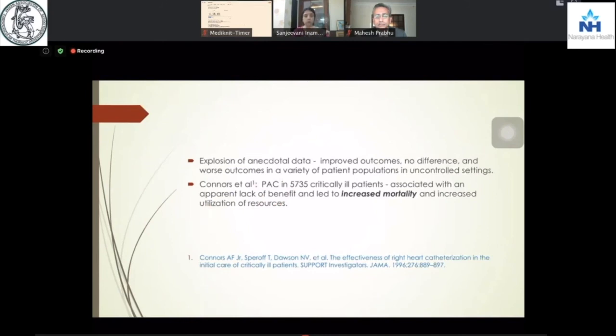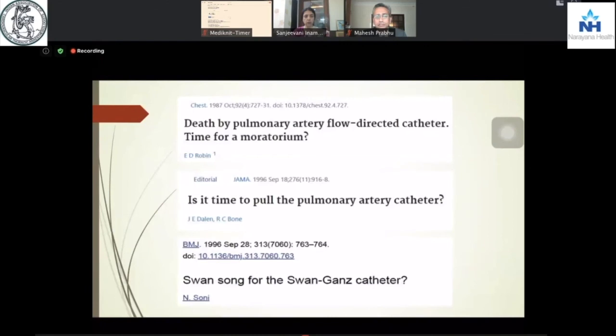And soon a backlash followed, and many editorials started appearing in some of the leading journals, with topics such as death by pulmonary artery flow-directed catheter. Is it time for a moratorium? And is it time to pull the pulmonary artery catheter?